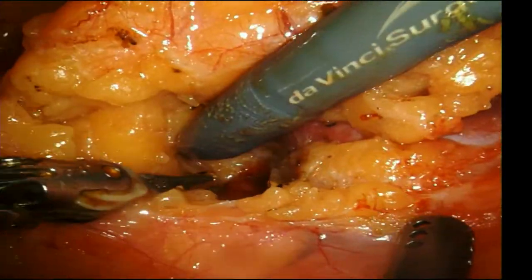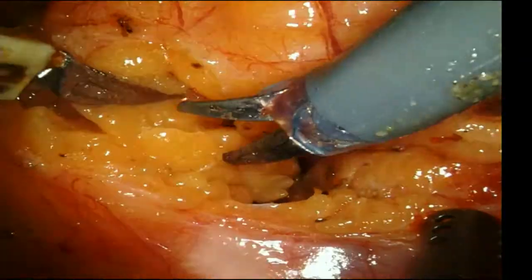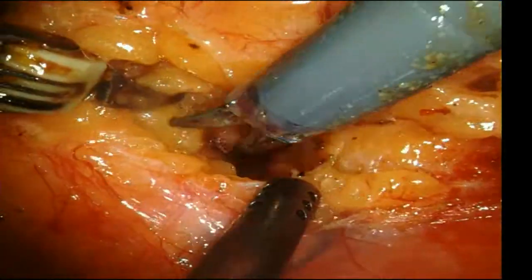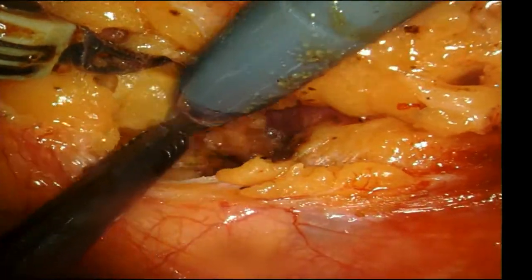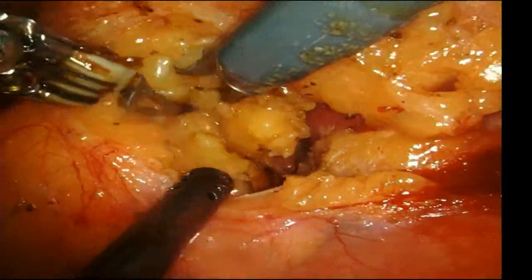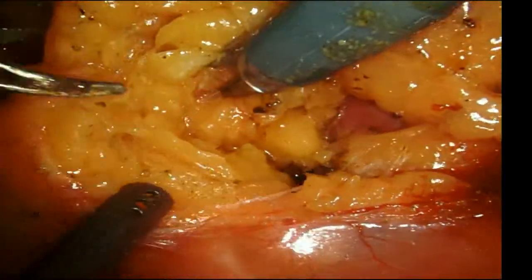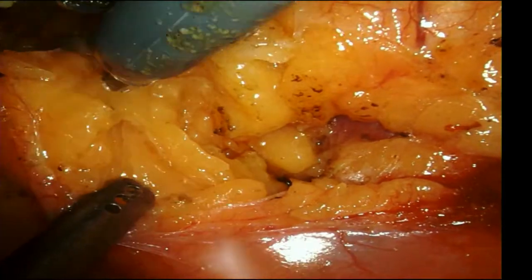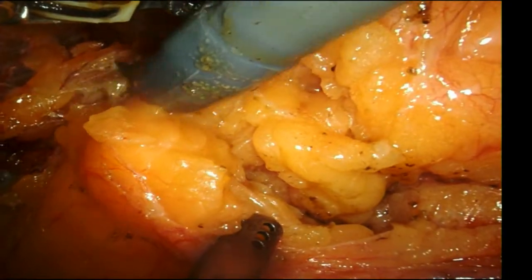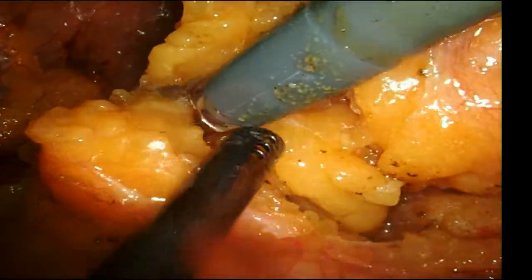There's a question from the audience about your cautery settings, Ronnie. Yeah, same as the prostate that we did before. If we were using the Erbe, you're hearing some of the feedback from the cautery. It was even worse when we were using the Erbe. That's why we had to switch it. We were just getting a lot of feedback for some reason. I think there's some kind of interference. But usually with the Erbe, we would use 4 on the monopolar, 3 on the bipolar. This is just a regular cautery unit, a Force Triad Bovie unit, and we're using 25, 25, and then we usually will go up to 40 once we get the bowel out of the way. Did you guys go up to 40 yet? Can you go up to 40 if you didn't already?